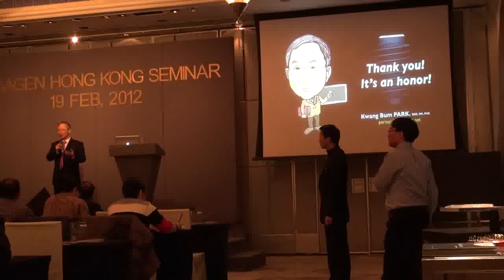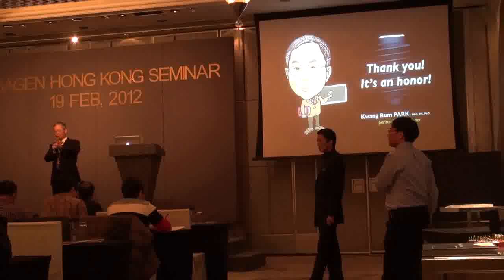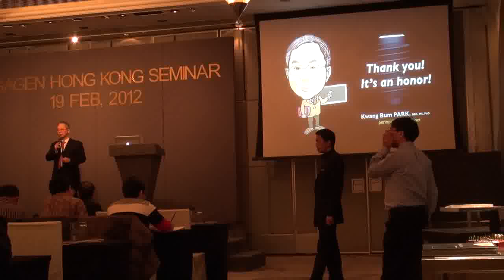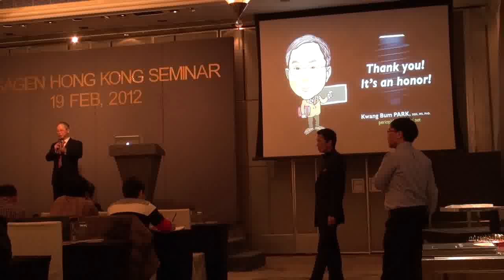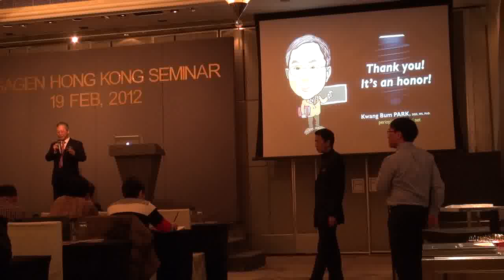According to the bone density, on the maxillary arch, you can start to place implants after 2.9 millimeter. 2.9 is very small, only a 2-step drill, 2 millimeter and 2.9, and the 5 millimeter diameter implants can be placed when the patient has type 4, very loose bone. On the mandible, to place 5 millimeter implants into hard bone, like D1 or D2, you have to drill almost the same diameter as the implant.